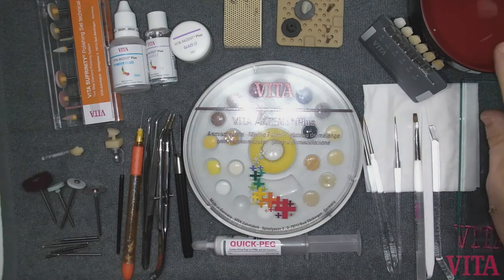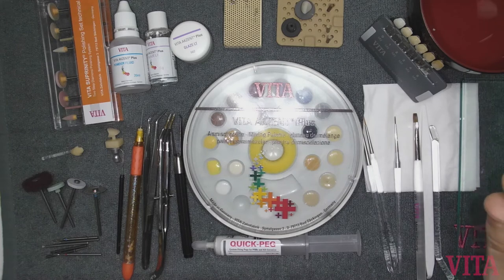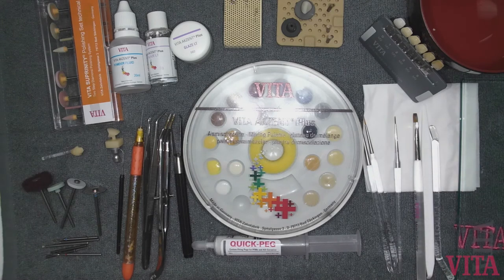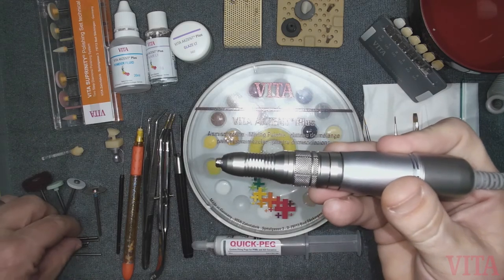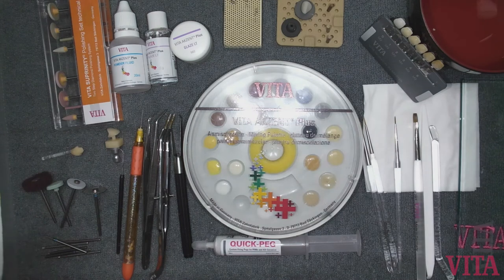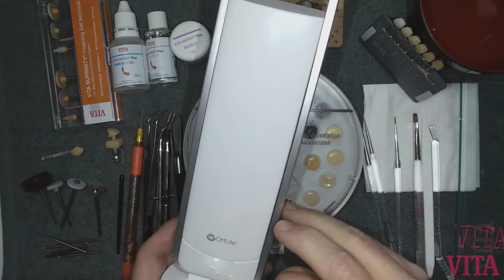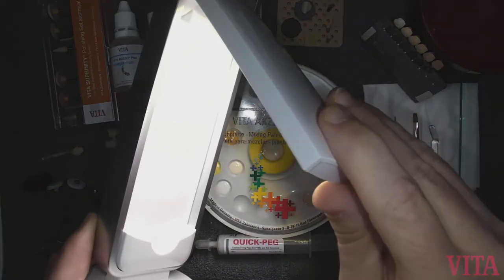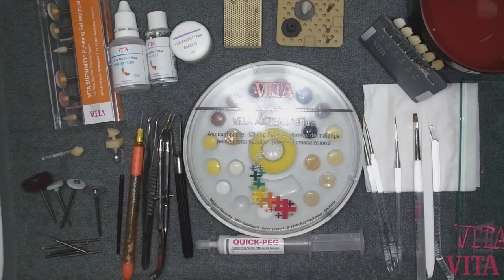You're also going to need some distilled water. Make sure you use distilled water to rinse your brushes when going from one color to another so you don't contaminate the various colors. You'll also need a slow-speed handpiece for your rotary instruments. And of course, you'll need a bench light — this happens to be an OTT light, battery-operated LED with a true white color. And there you have it — these are the instruments and tools you need to get started to texture, stain, and glaze, and create your nice-looking restoration.